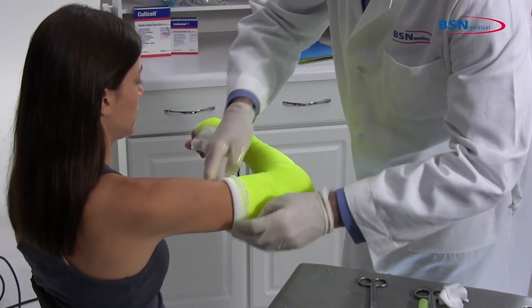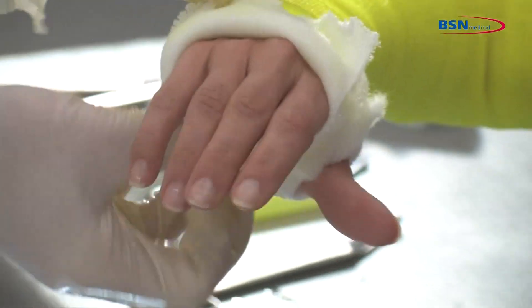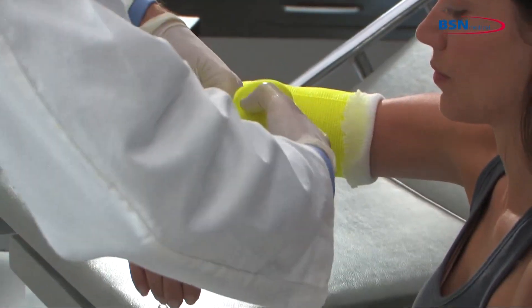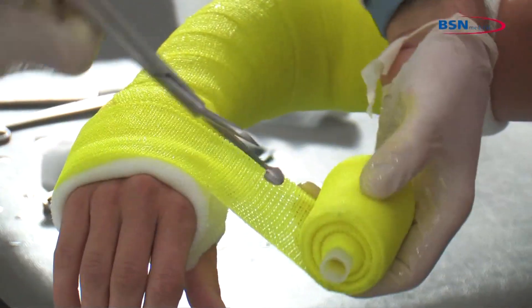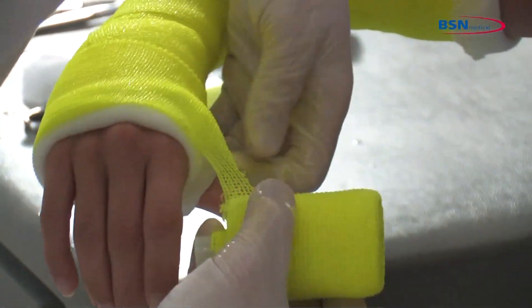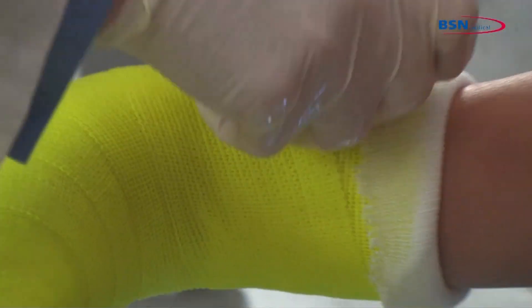Fold back the stockinette at the proximal end, thumb, and distal side for protection of the skin and creating a soft end. Take a second roll and dip 2-inch or 3-inch cast tape in water, squeezing 1-3 times. Remove from water and squeeze 1 time to remove excess water. Start wrapping the cast at the wrist and go through the web space. Go around the hand and continue with 50% overlap toward the elbow. Avoid placing the edge of the cast tape in the anti-cubital fossa and continue wrapping toward the upper arm with 50% overlap.